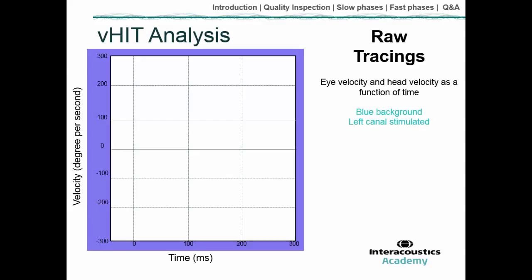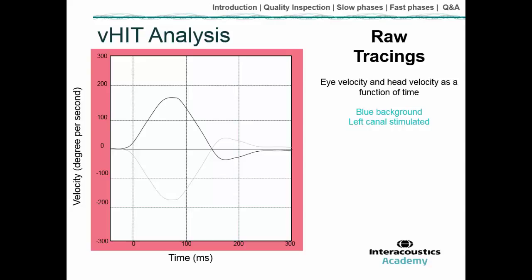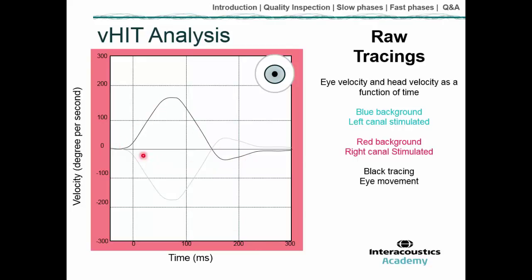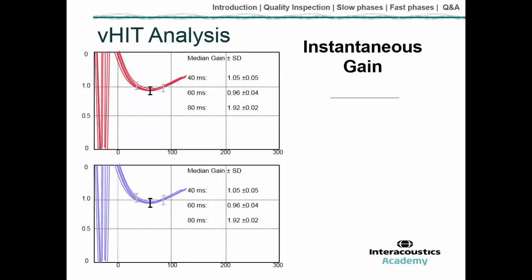The colour of the background is important: a blue background indicates the left canal has been stimulated, and a red background indicates the right canal. On the raw recording, the black line corresponds to eye movement and the grey line corresponds to head movement. We're looking for the eyes to move in an equal and opposite direction to the head, which is what the VOR does when working correctly. The next graphs show instantaneous gain, which displays the slow phase VOR response — the true vestibular response.